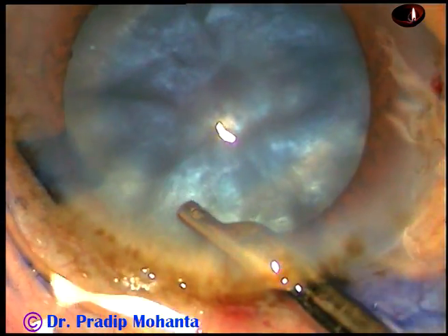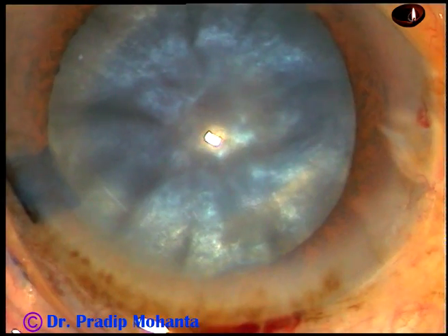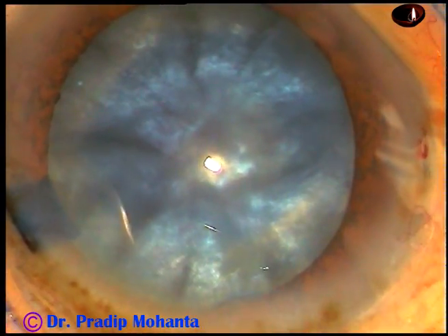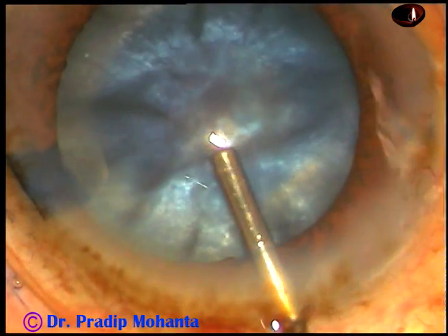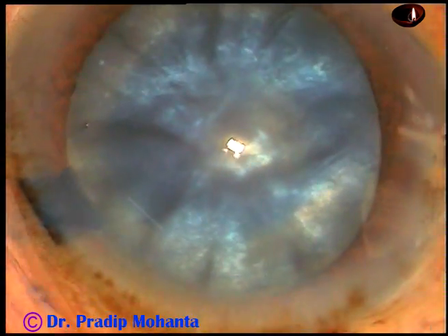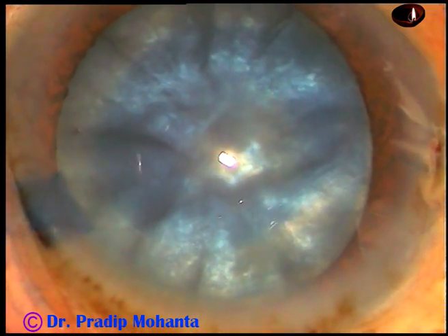And then viscoelastic substance is injected into the anterior chamber. And this is 2% hydroxypropyl methylcellulose. The methylcellulose has been injected and the anterior chamber has been filled by this visco.